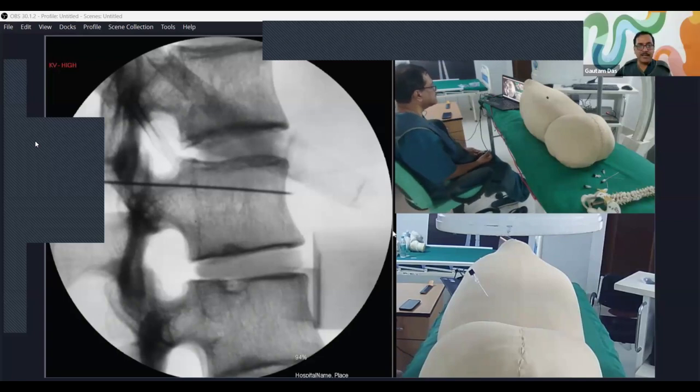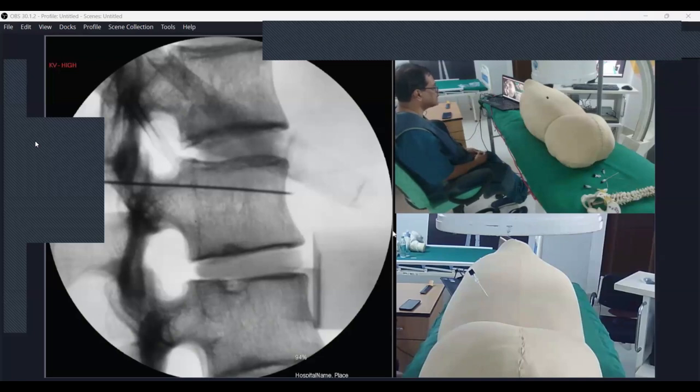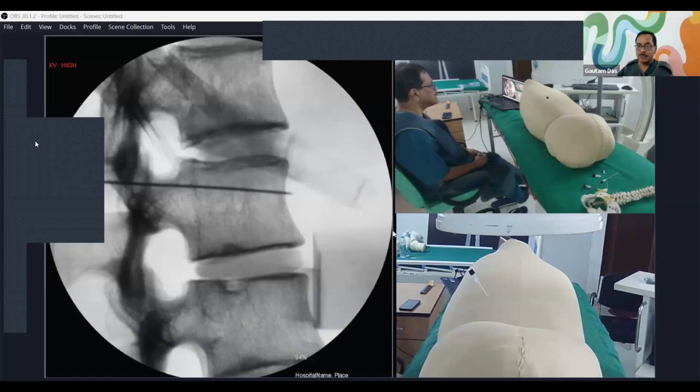Actually, the splanchnic nerve forms the celiac plexus, isn't it? That means the indications are all the same. It is upper abdominal pain. But for benign conditions like chronic pancreatitis and calcific pancreatitis, we prefer radiofrequency of the splanchnic nerve. For cancerous conditions like CA of pancreas, biliary tract CA, gastric carcinoma, any upper abdominal malignancy, you can go ahead with the celiac plexus block. But the celiac plexus block is easier than the splanchnic.